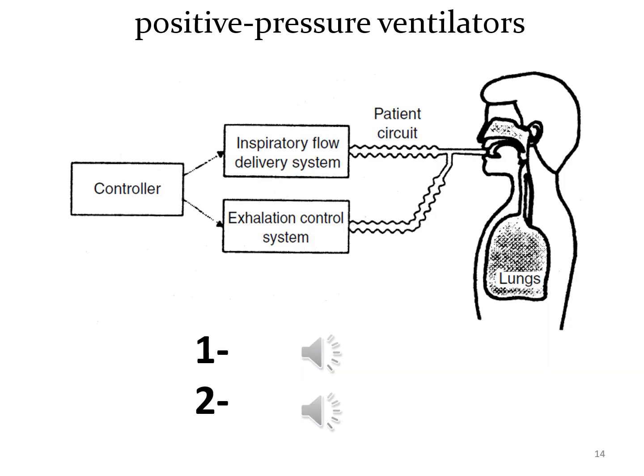Positive pressure ventilators work by increasing the patient's airway pressure greater than the atmospheric pressure through an endotracheal or tracheostomy tube. This causes the lungs to expand due to internal pressure and then to recoil naturally, expelling a portion of the air once the positive pressure is removed.